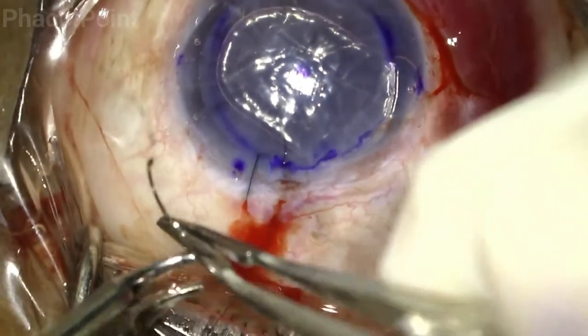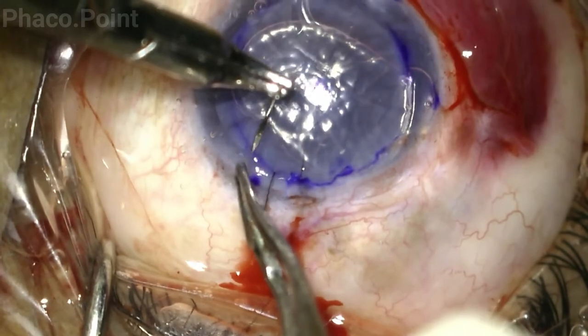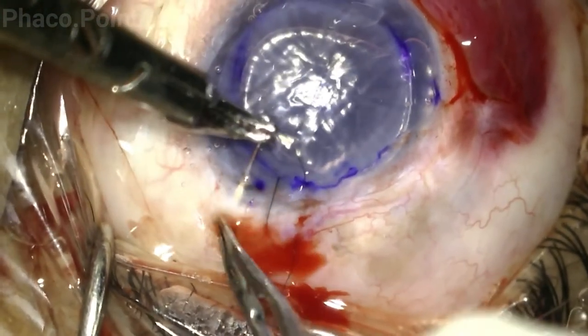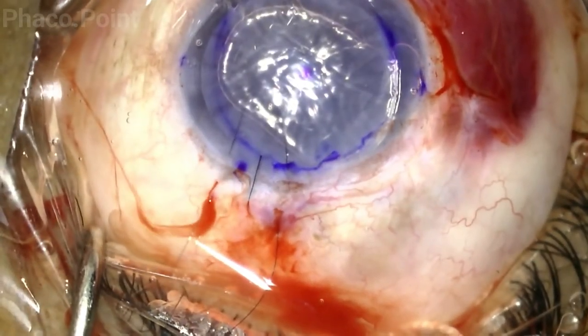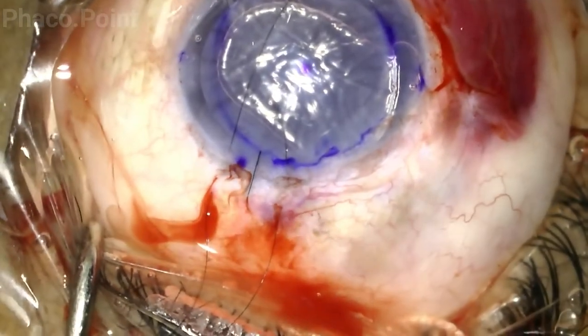The suture is cut, the needle is re-grasped in a similar manner, and another suture is taken next to the pre-existing suture. You need to ensure that a similar length from the limbus to both the scleral end and the corneal end of the suture is maintained.